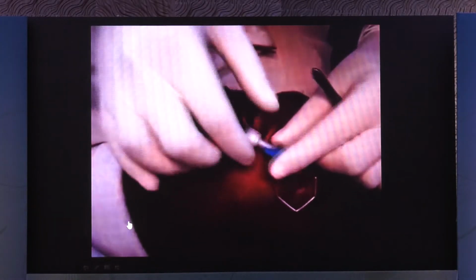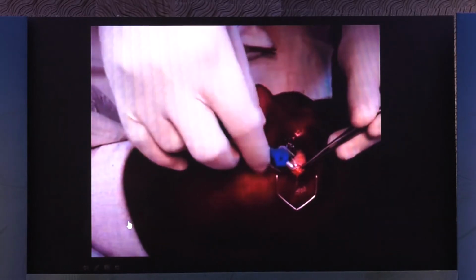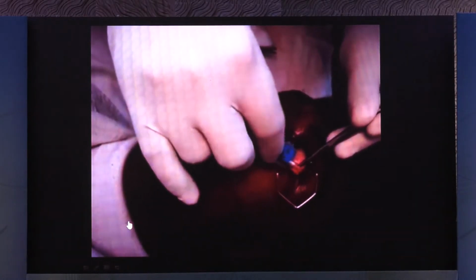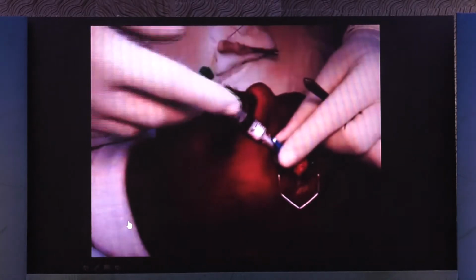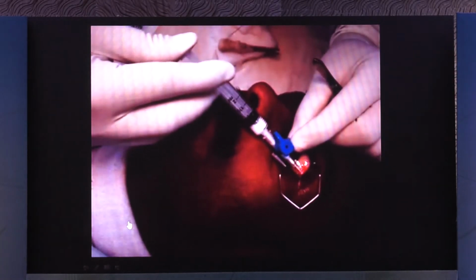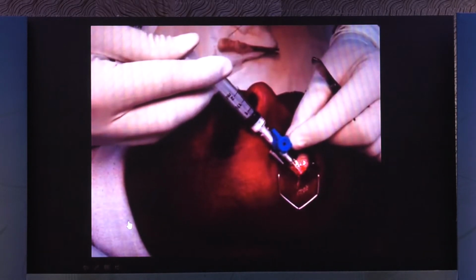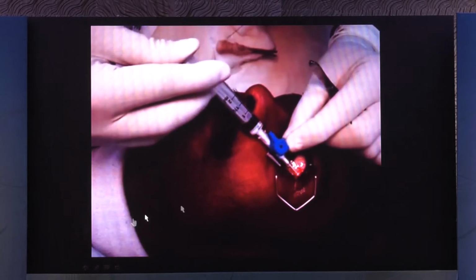The advantage of this is that there is minimal chance of globe perforation, because the stylet is already out and you are giving the injection with a non-traumatic polytetrafluoroethylene cannula. Since it is longer, there are very high chances that the drug will go as posterior as possible, having a maximum effect.